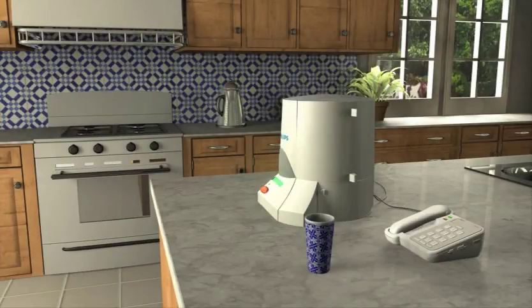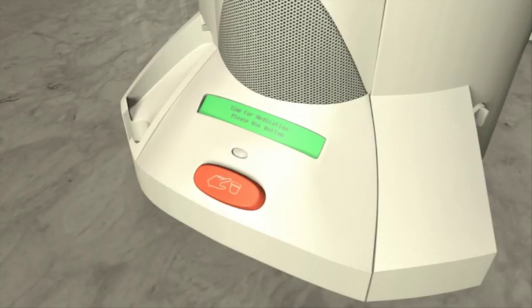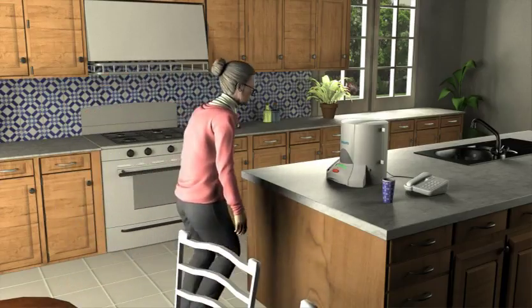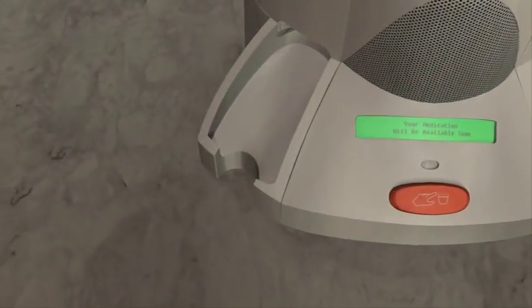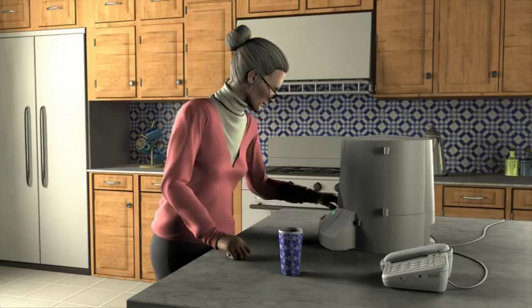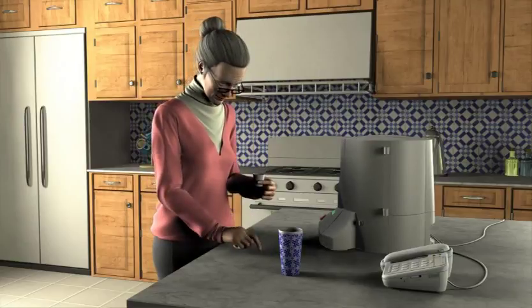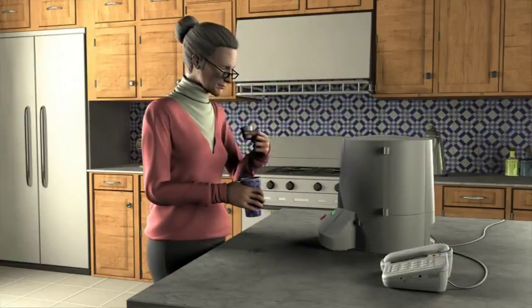When a scheduled dose is required, the dispenser button flashes on and off, and the medication dispenser sounds a vocal alert. Time for your medication. Press button to dispense. All the patient needs to do is press the button and the dosing cup will drop. The patient simply picks up the cup, removes the cap, and takes the medication.